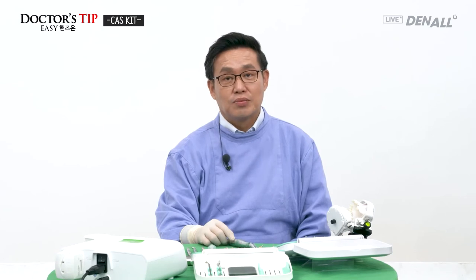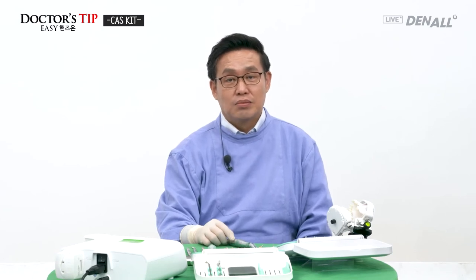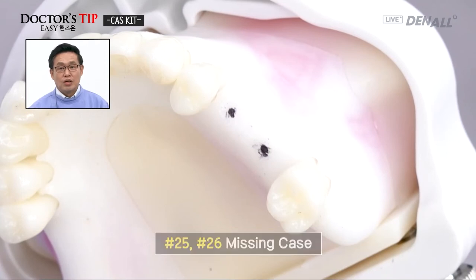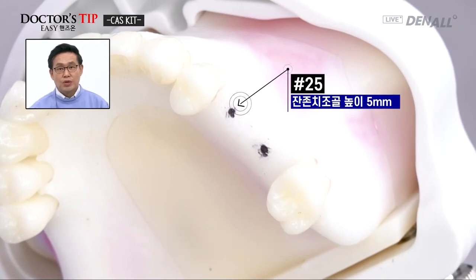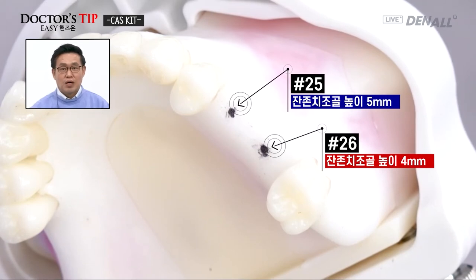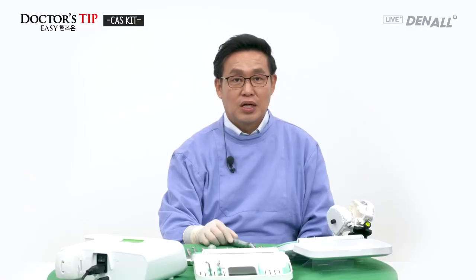CAS kit hands-on. In this practice, 25 and 26, two teeth are missing. At 25, the residual alveolar bone height is 5, and at 26, it's 4 millimeters. But the alveolar bone is slightly sloped near the adjacent teeth. Therefore, we need to go deeper to penetrate into the sinus floor. Now let's start the hands-on.